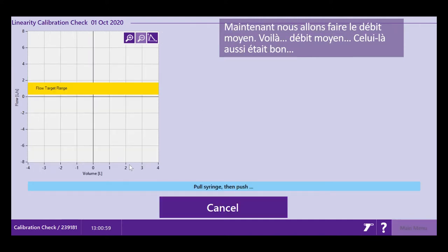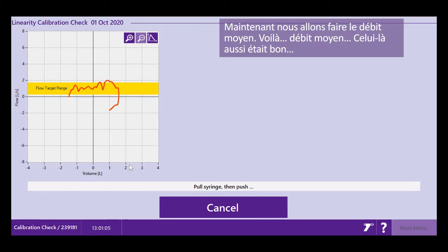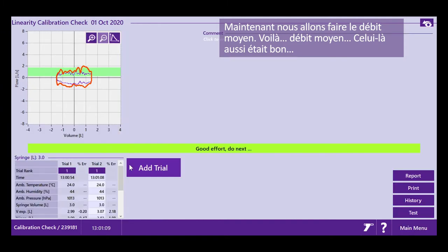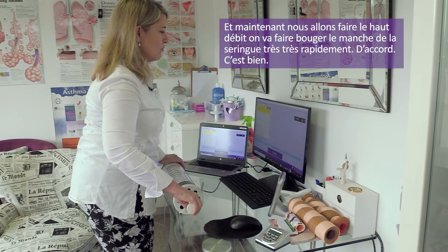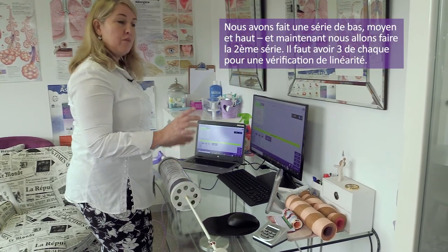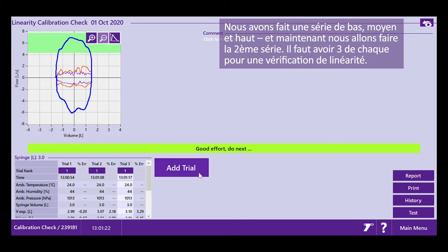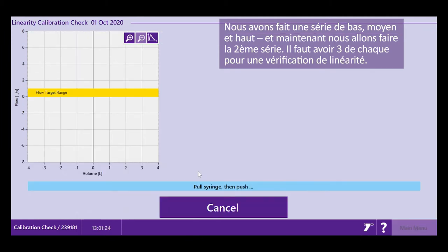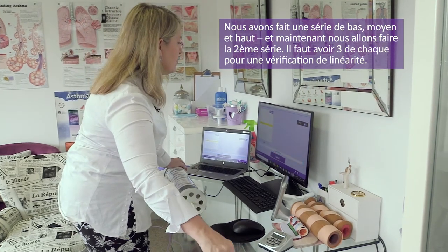That was within low flow. Now medium flow — and that one was good. Now high flow — we move the syringe handle very, very quickly. We've now done one set of low, medium, and high. For a linearity calibration check, you need three lows, three mediums, and three high flows.